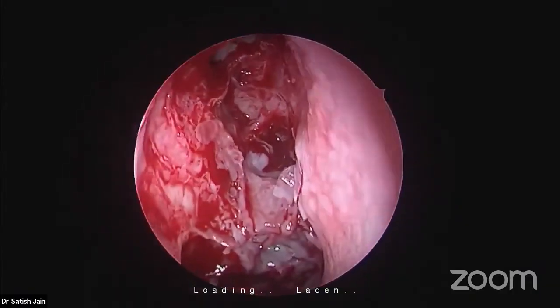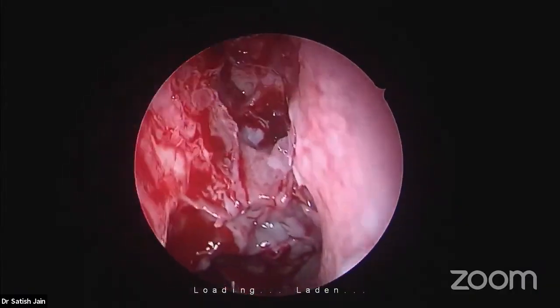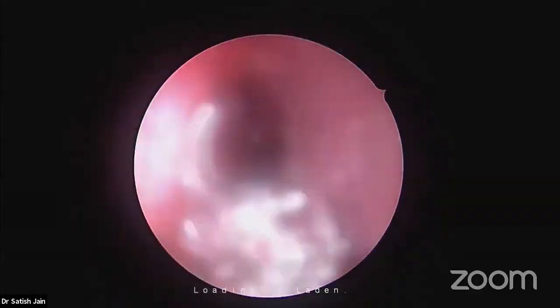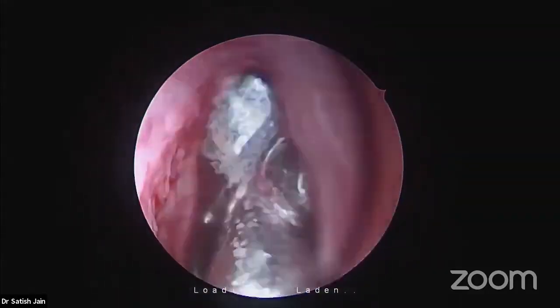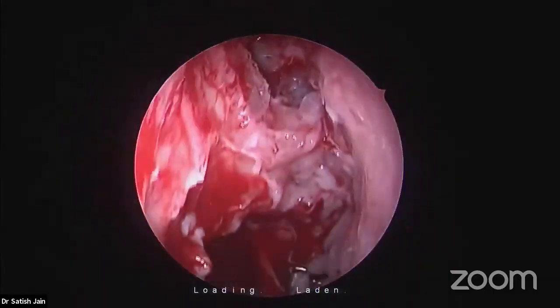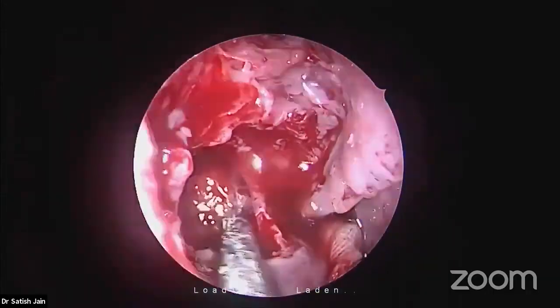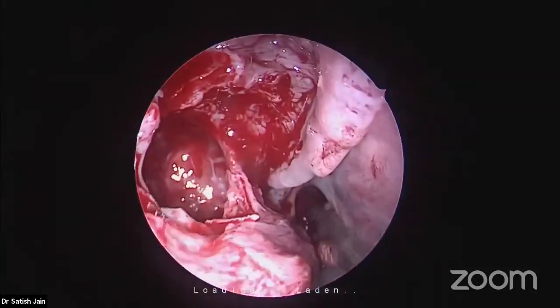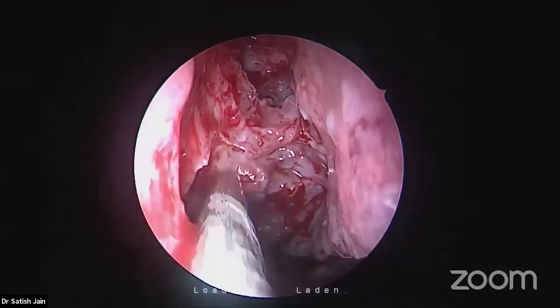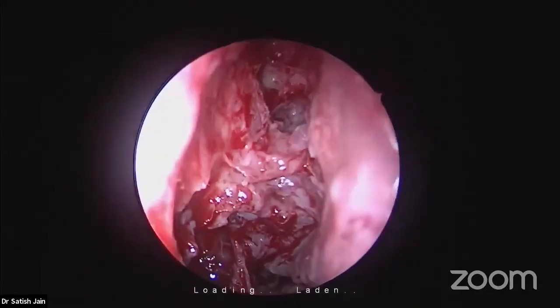Means behind that, the roof of the posterior ethmoid should start. Now see what is there, a few millimeters behind. Just a minute, clean up. That's a very important point I'm going to mention now for orientation.